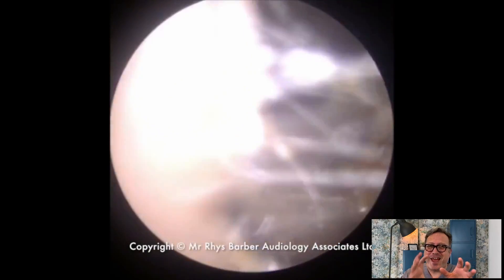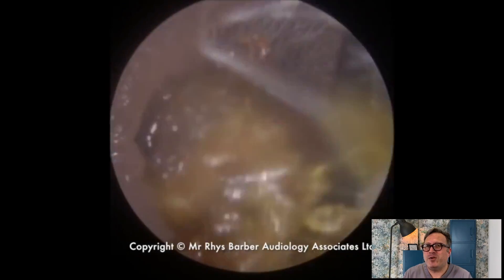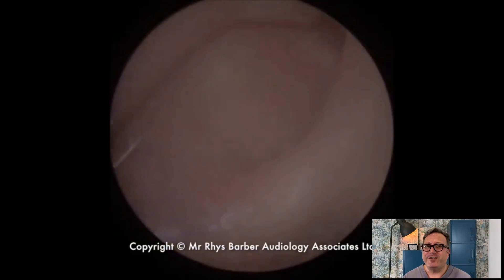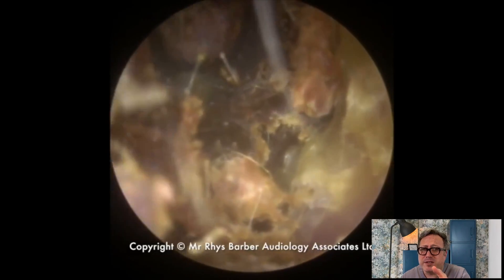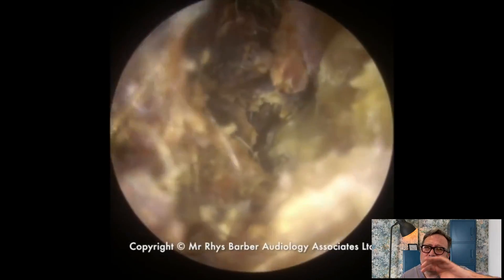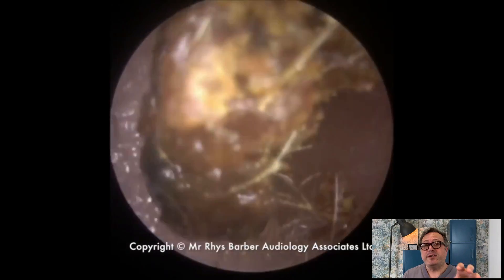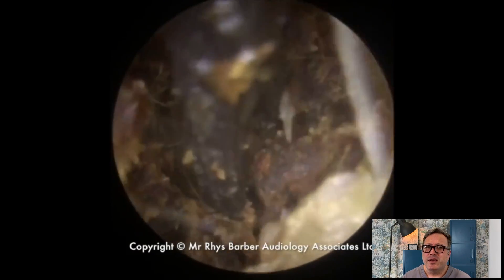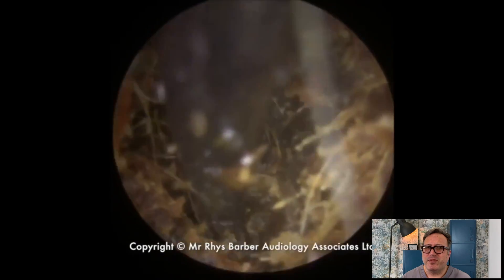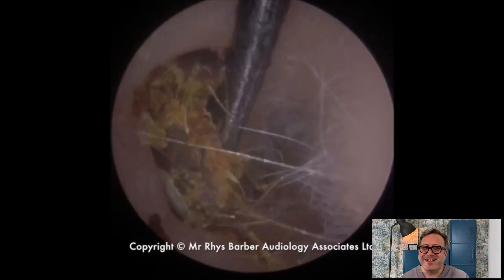We've got a grip on that outer section — look how it pulls, it's still attached to the piece behind, pulling that long strip. At this point I probably would have gone in with crocodile forceps to keep it in one piece, but that's just sheared the front end off. Now I can see how dark the wax material is behind — lighter material on the outside is dry flaky skin embedded in the wax, while the wax itself oxidises darker and is much, much harder — just like a solid wall in there.